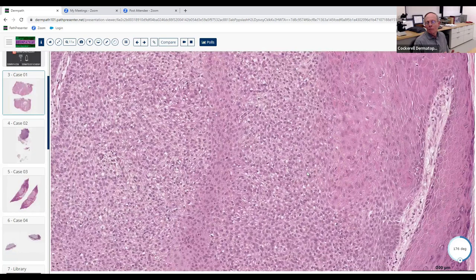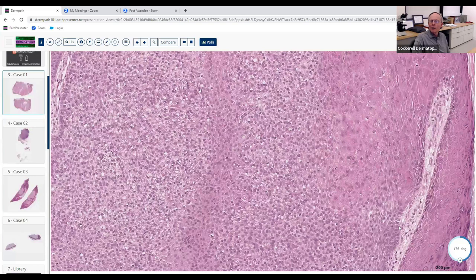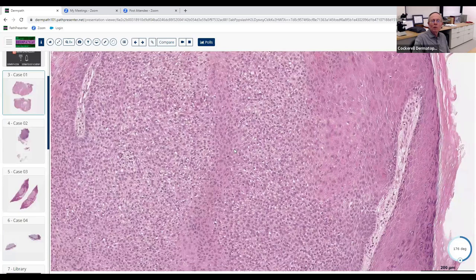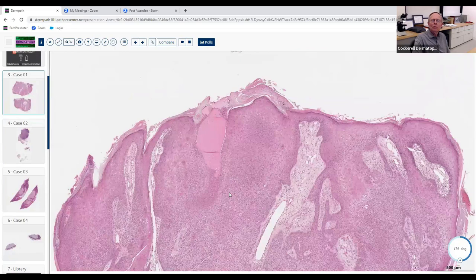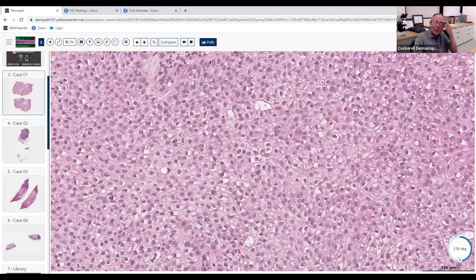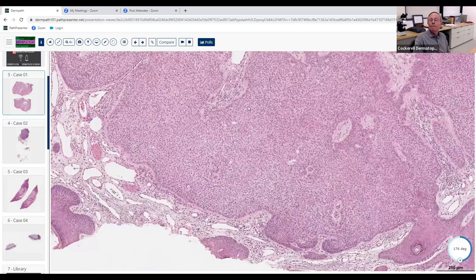Does poroid usually give you more than one cell type? Usually no — typically it's very monomorphic. So it would be a little unusual to see this kind of differentiation that's more basaloid peripherally and more germinative in the center with these clear cells. You can get a clear cell component of poroid, but poroid lesions are usually very monomorphous — cuboidal and basophilic.